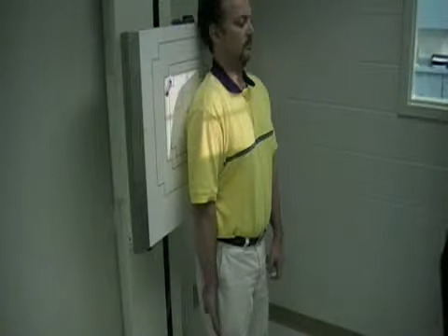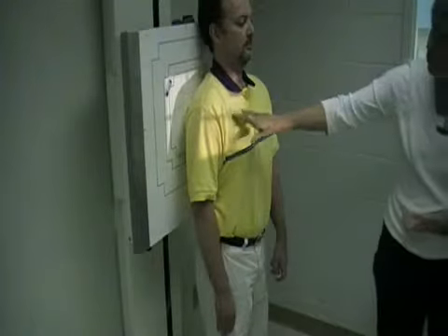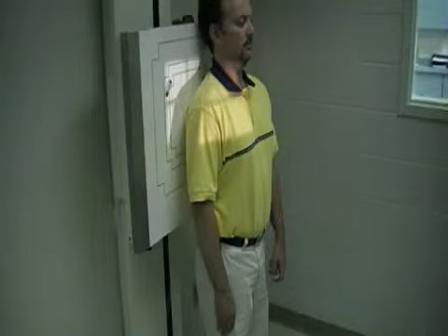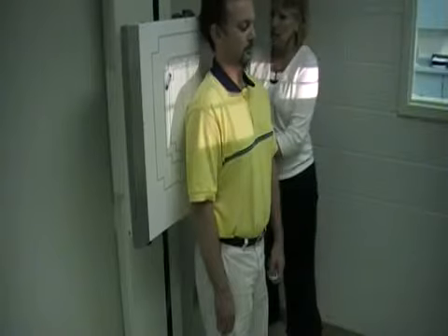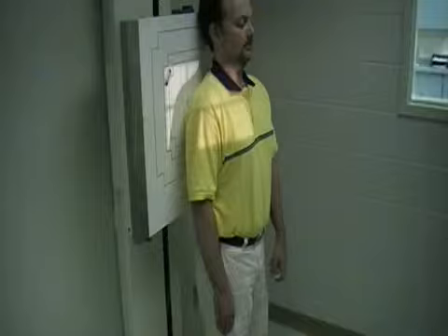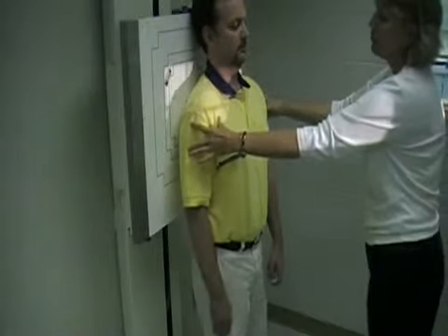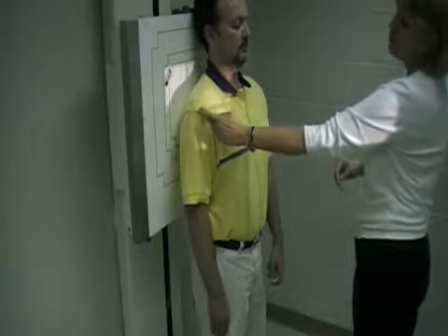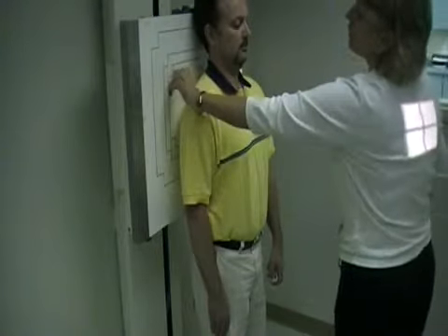Alright, next is the AP projection for the clavicle. So with the clavicle, you want to be centered right at the level of the clavicle. So I'm just going to move our central ray up just a little bit higher. Whenever you move your central ray, you want to adjust your bucky accordingly. And then you want to have the central ray at mid-clavicle. So I'm just going to move David just slightly to the side. You want to be sure you include the 2 ends of the extremities of the clavicle as well.